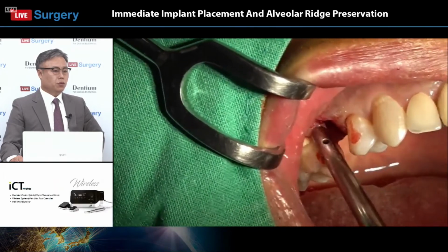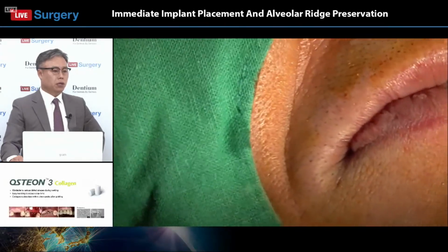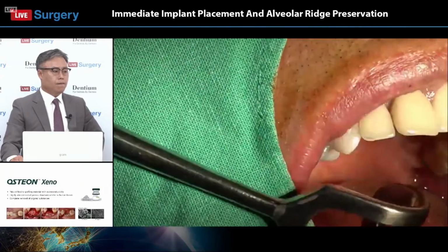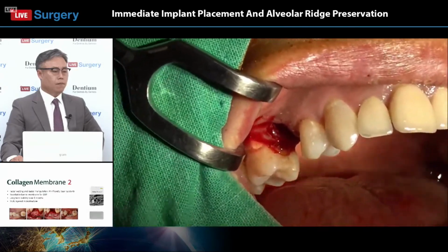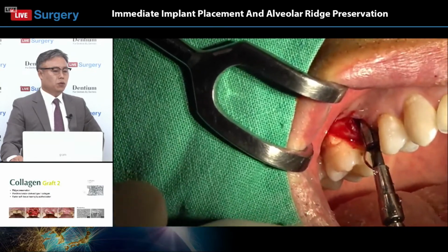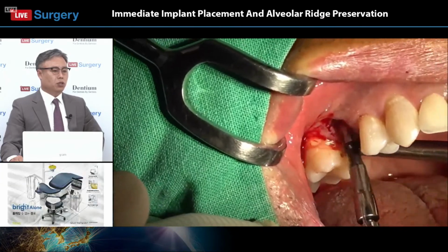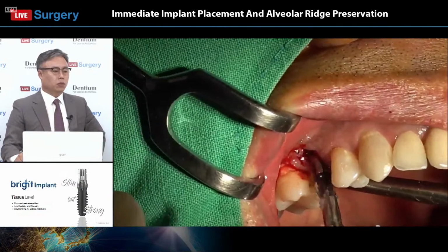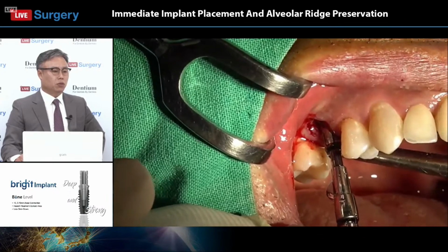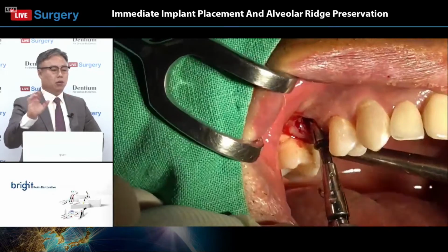The granulation tissue remover, and probably he will place the implant. We will start the bony site preparation for the implant placement. As we saw in previous similar cases, usually the position of immediate implant placement for the second premolar area is in the middle of the extraction socket. Usually in the anterior tooth area, we place the implant palatally and leave some gap defect on the buccal side.